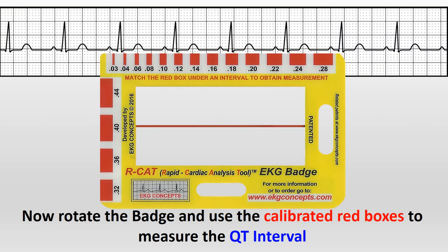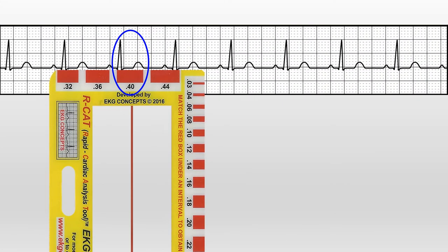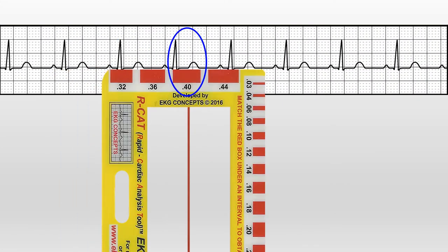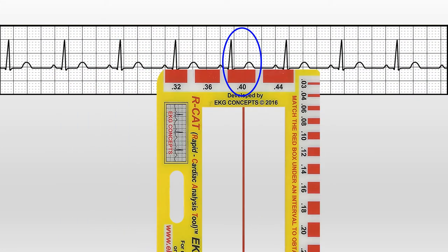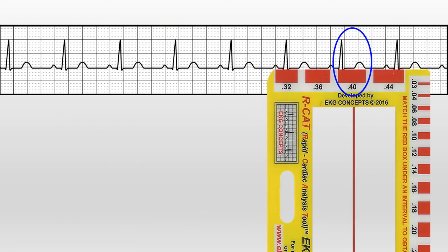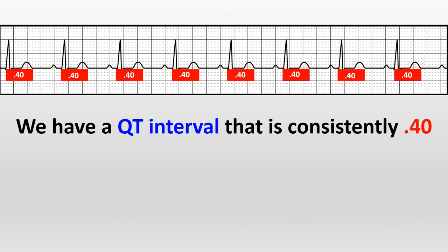Now rotate the badge and use the calibrated red boxes to measure the QT interval. We have a QT interval that's consistently 0.40.